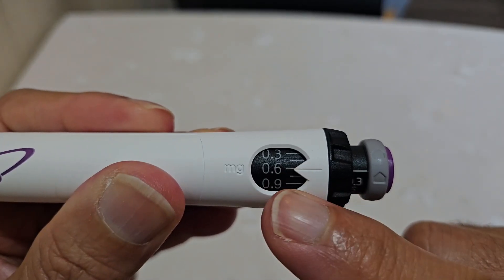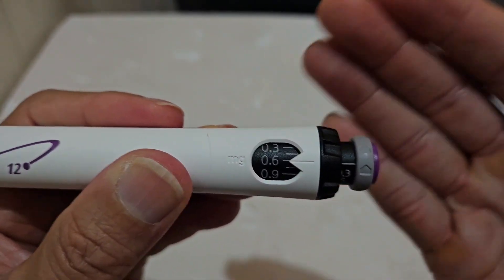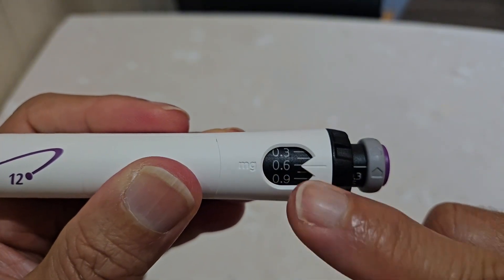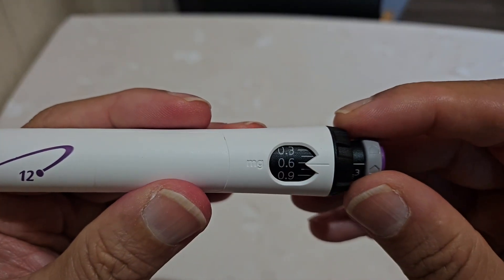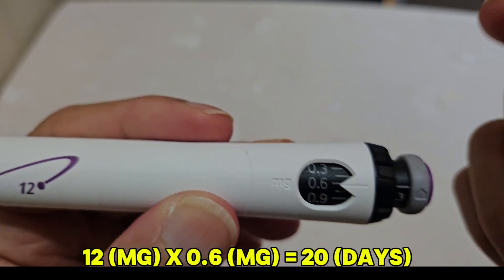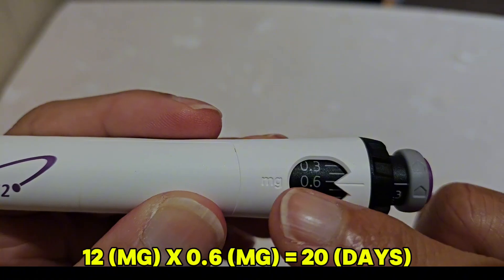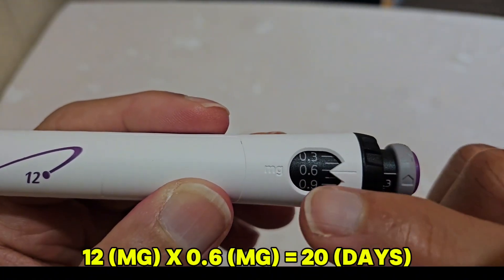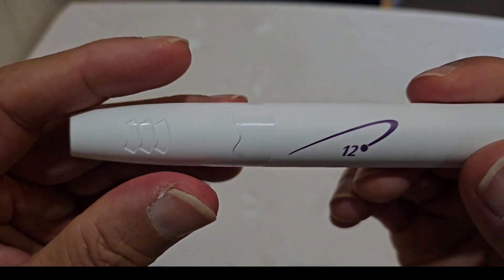Another important question: if I set the dial at 0.6, how long can I use the pen for? The short answer is 20 days — 20 injections before it's over. You divide 12 milligrams by 0.6 and you get exactly 20. So if you set it at 0.6, this pen will last exactly 20 days.